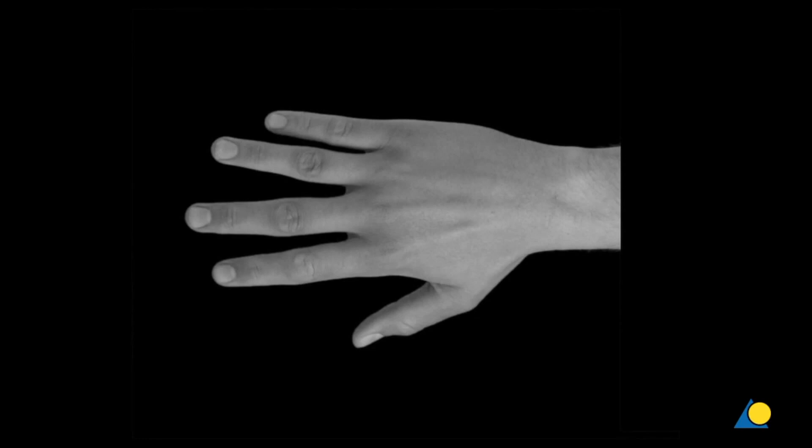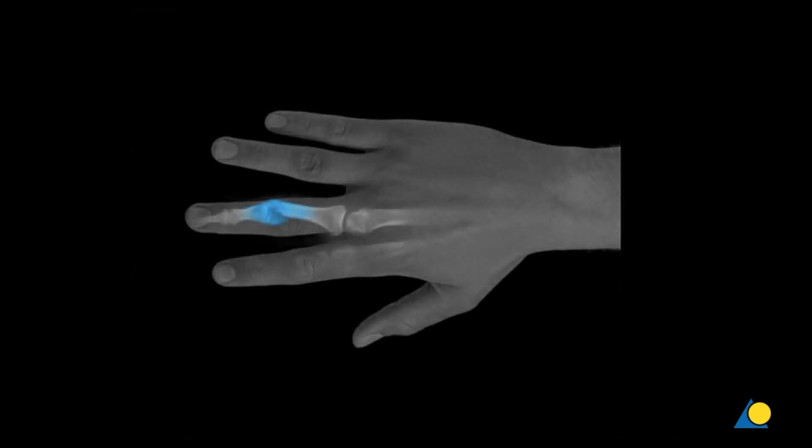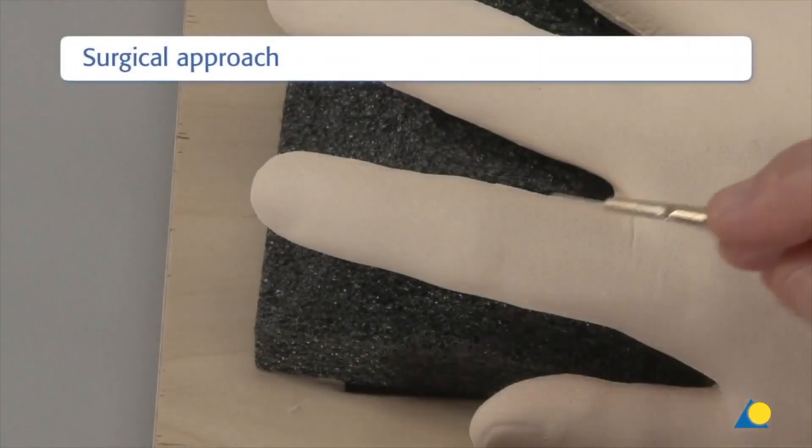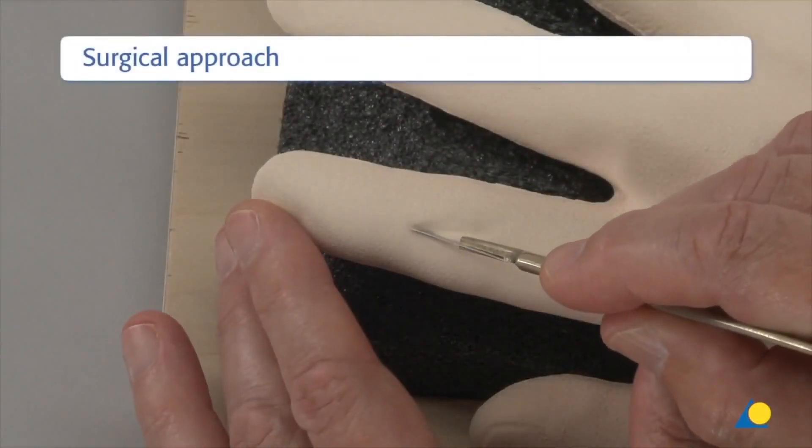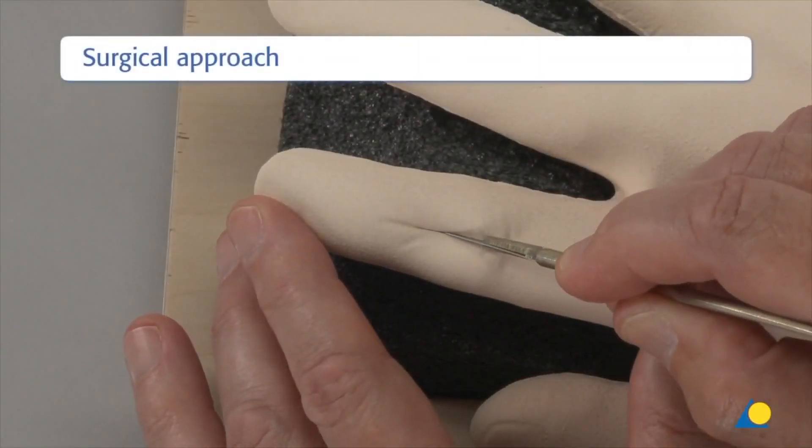The dorsal approach to the PIP joint is made through a curved longitudinal skin incision. It is also possible to use an S-shaped incision if there is an existing injury or a longitudinal midline incision for an arthrodesis. A straight dorsal longitudinal incision is made on the PIP joint of the index finger.